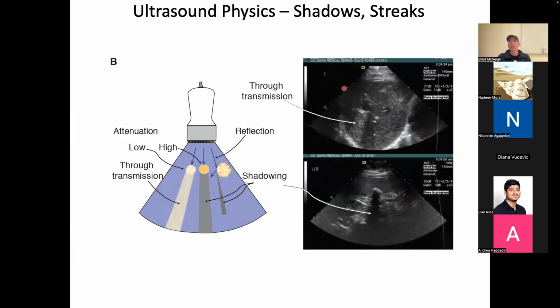So the other things that happen when you look at an ultrasound image, you'll see sometimes a dark streak in the image. So this is the baseline tissue. This is, as you can see, some kind of correlated dark streak. This is a very bright streak. And so if you have a low attenuation object, the signal will get interpreted as having low reflectance here and higher reflectance on the back. And if you have something that shadows or has high reflectance, a lot goes back, and then it underestimates the reflectivity of the stuff behind it. And so these streaks show up.